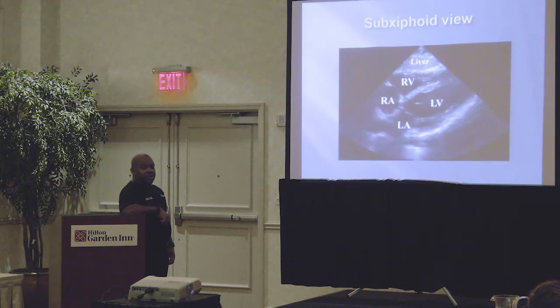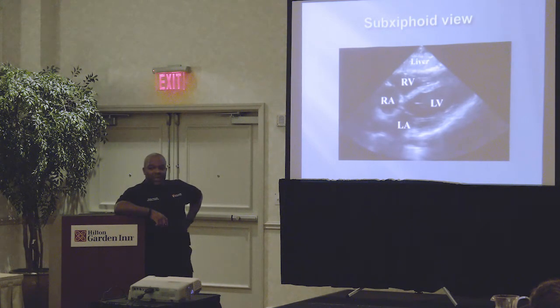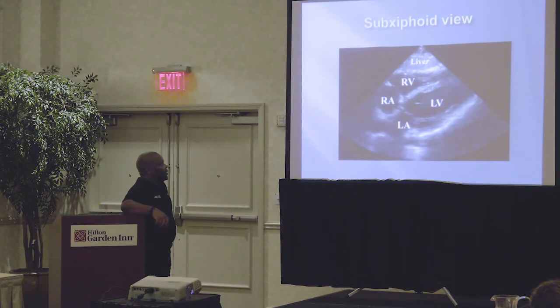This is the interventricular septum, all right? So if you have a patient that comes in and they tell you that they had surgery on their knee about 3 weeks ago, and they got up to go pee, and now they're significantly short of breath. And they come in, and they look terrible. Pulse ox is hovering around 85, 89%, all right? And they just look awful. And they tell you they have this vague chest discomfort. What do they got? They got a PE, all right?